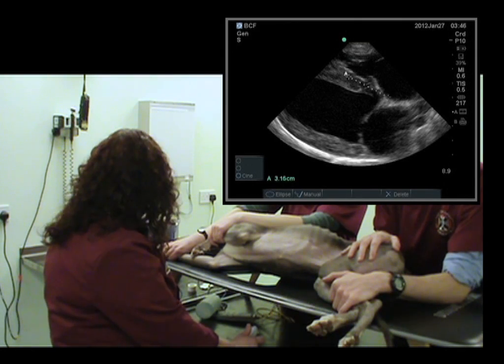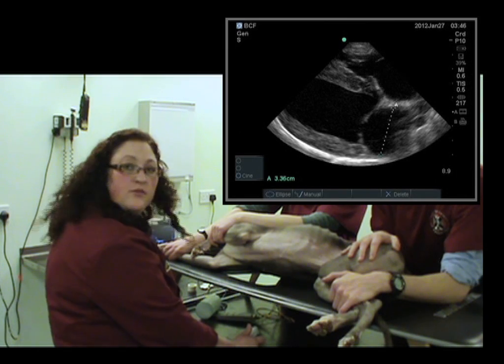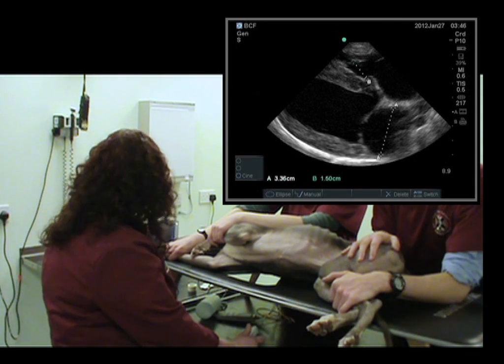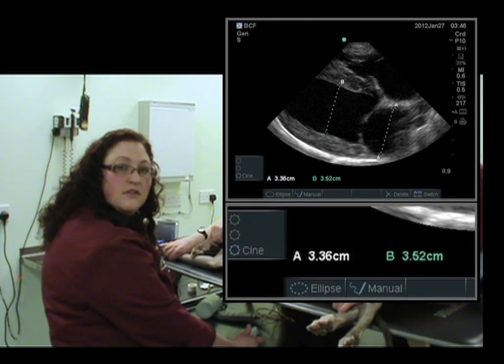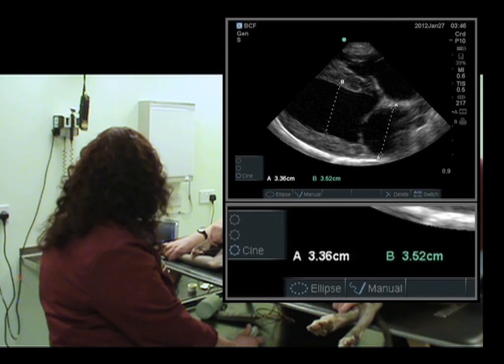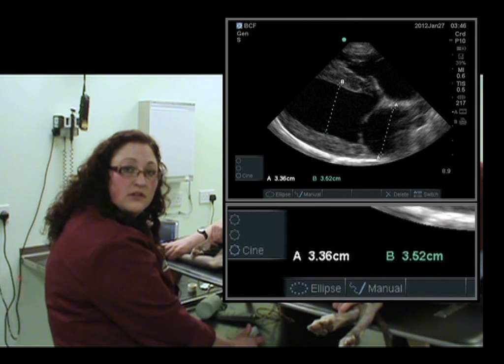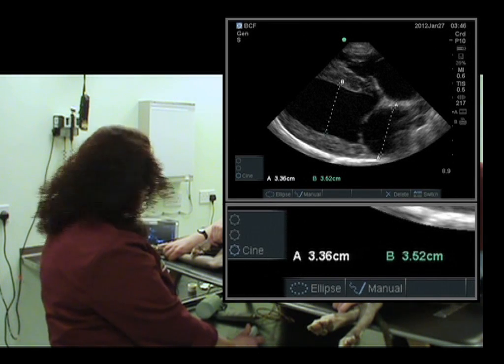We'll now perform some measurements looking at the diameter of the left atrium compared to the left ventricular internal diameter during diastole. I've put on my calipers and we've made a measurement of the left atrium. We'll now look at the left ventricular internal diameter. As you can see, the measurement of both is around about three and a half centimeters. The ratio should be one to one for the diameter of the left atrium and the left ventricle internal diameter, and that's what we have in this case — this is a normal dog.